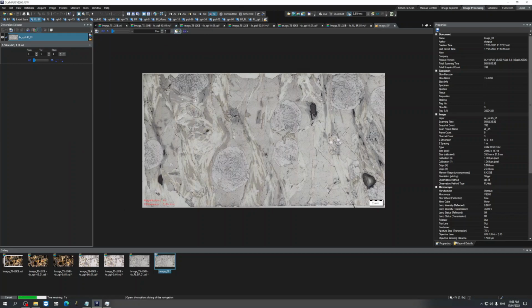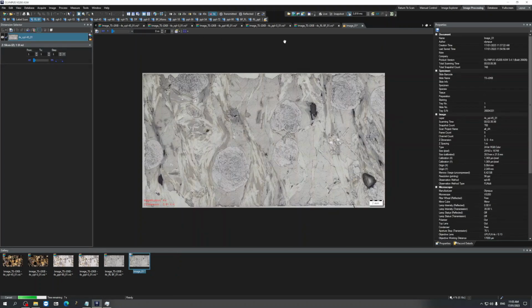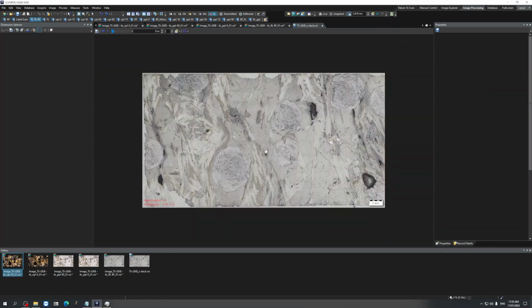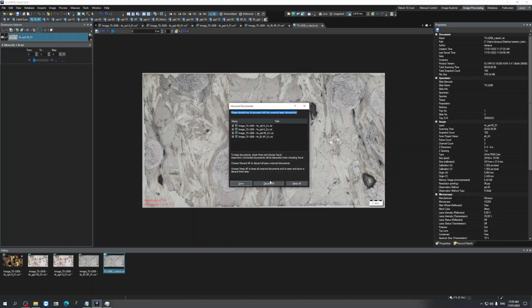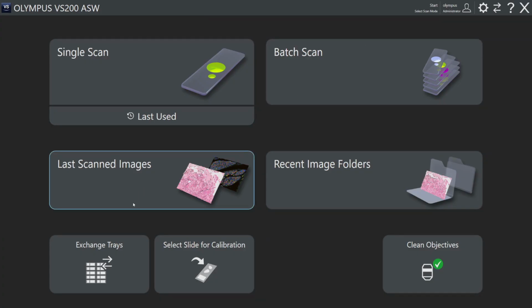While this is taking place, you can already be closing some of the images, not all of them. Okay, now it's completed. You can discard all changes from all images. Close all, discard all changes, and that will finalize our session for today.